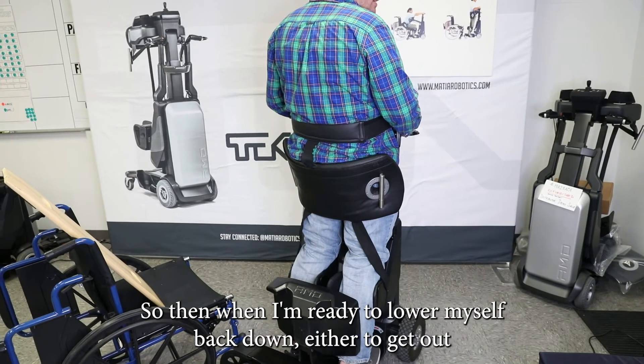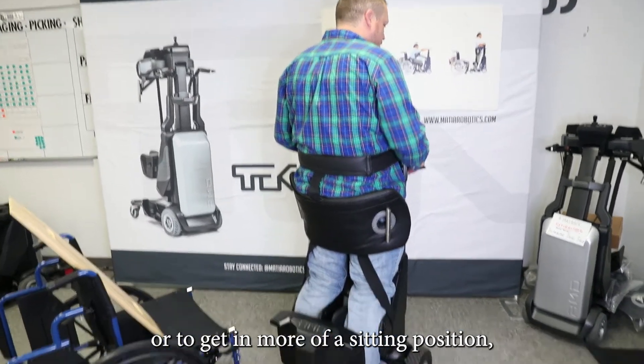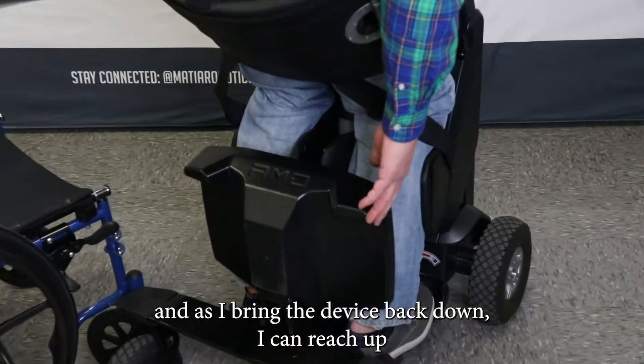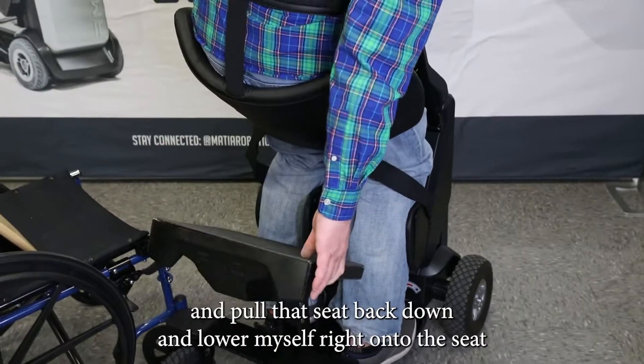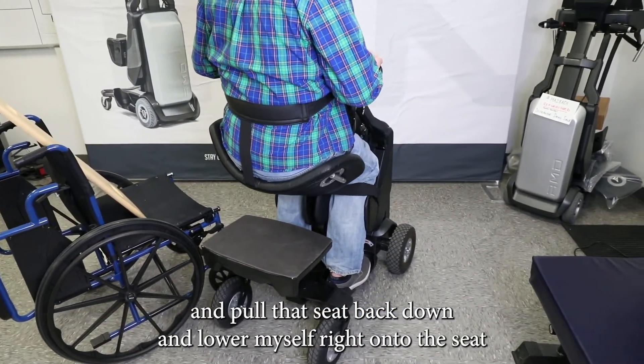When I'm ready to lower myself back down — either to get out or to get into more of a sitting position — as I bring the device back down, I can reach up and pull that seat back down, and then lower myself right onto the seat.